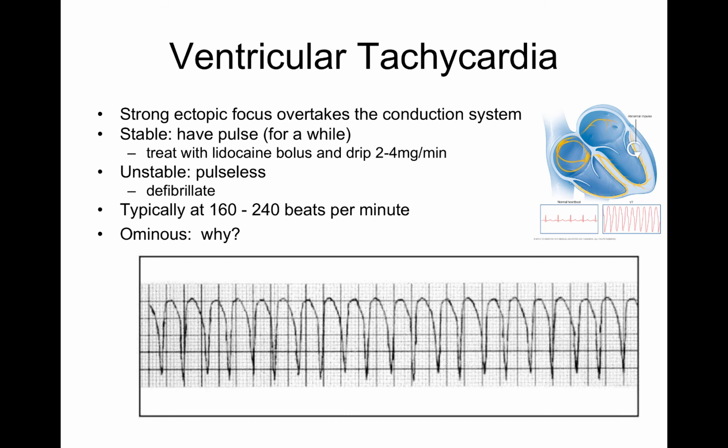So ventricular tachycardia is a life-threatening event, whether it is pulseless or has a pulse. If it has a pulse, we kind of sit back, but we're really concerned with them, and we will try to do medication therapy.